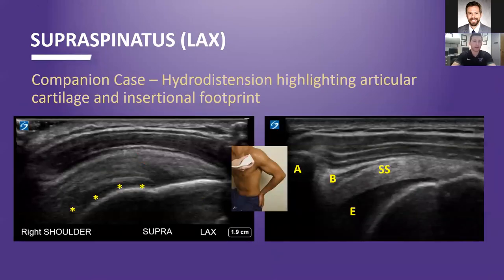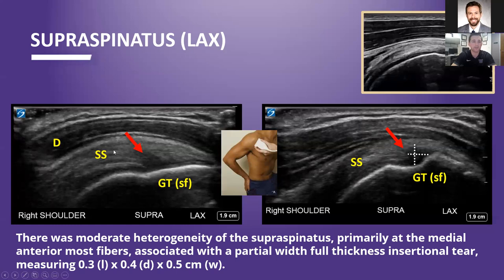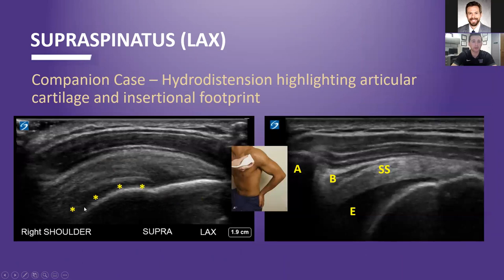One other thing to highlight is the articular cartilage. People often talk about hyaline cartilage and cartilage interface signs with tears. If your tear is insertional, there's no cartilage underneath that tear, so you're not going to see a cartilage interface sign. You'll see a cartilage interface sign if the tear is over the hyaline cartilage. This is where the hyaline cartilage really starts in that tendon, and this has become a lot more apparent to me as I've done more hydrodistensions — you can really see where that insertion is and that there's no cartilage underneath it.